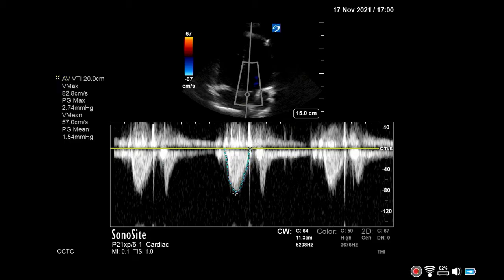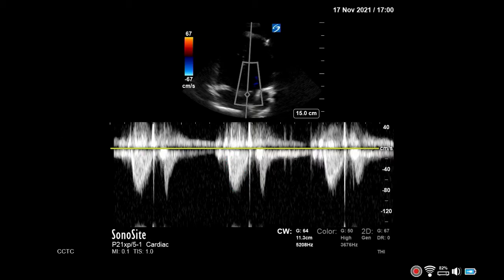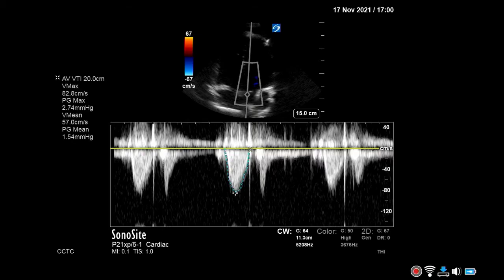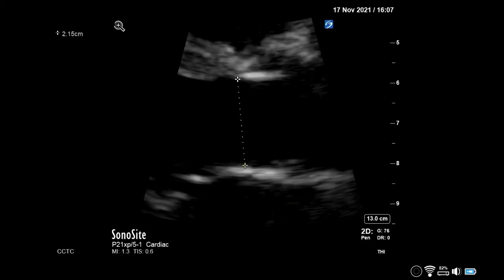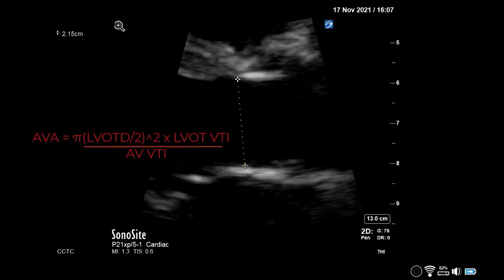In order to calculate valve area, use the aortic valve VTI, gather an LVOT VTI as well as the LVOT diameter, and apply these values to the continuity equation.